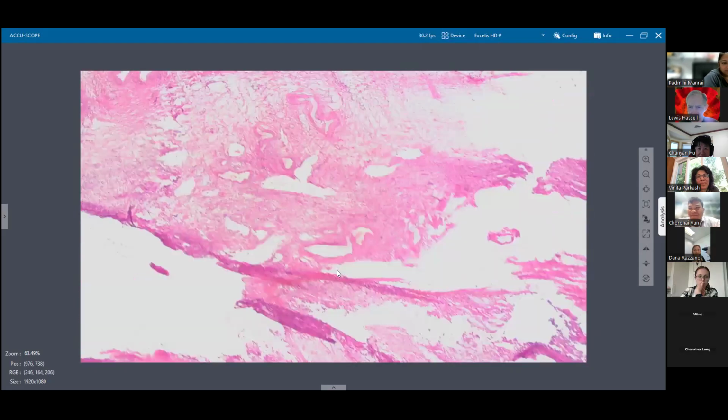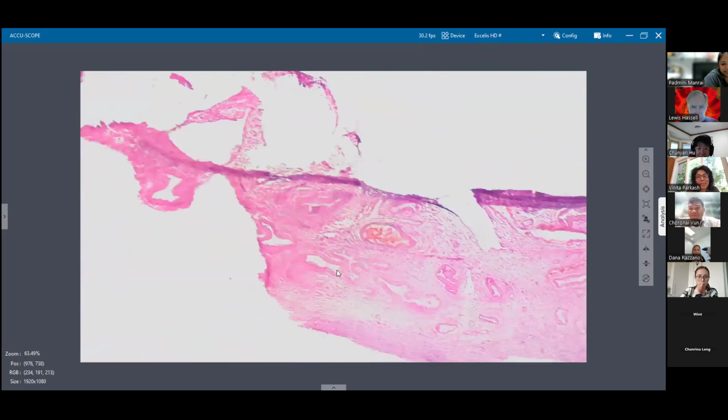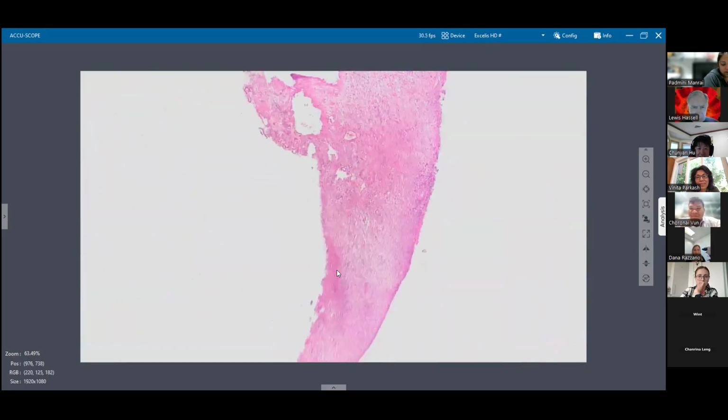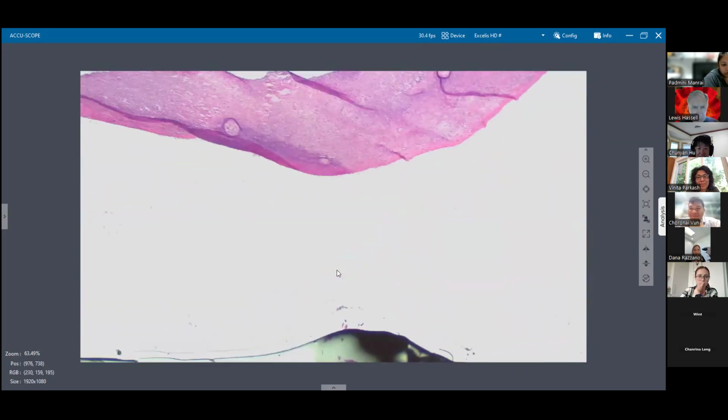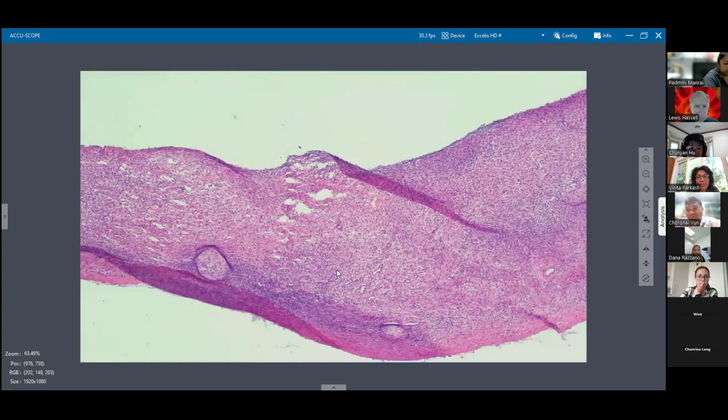And then we'll go up around and it connects down over here. Okay. So I'll start with the normal. This is normal ovary. And you can see this is the outer surface. So it looks pretty simple, benign, single layer. And this is ovarian stroma. You see that cellularity.